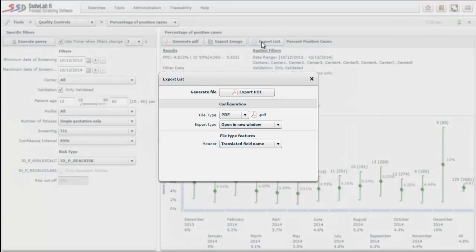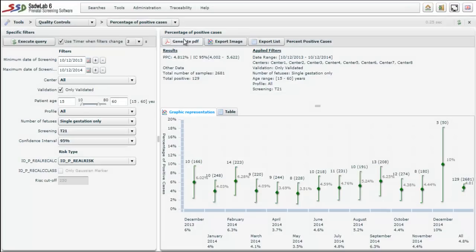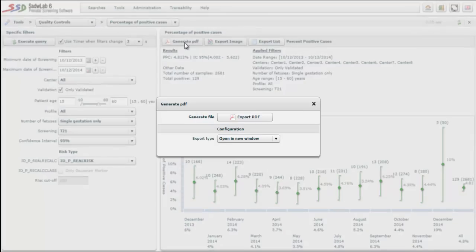We can export the data in different formats such as Excel, text, or others. The report presented on screen is what will appear in the printed version.